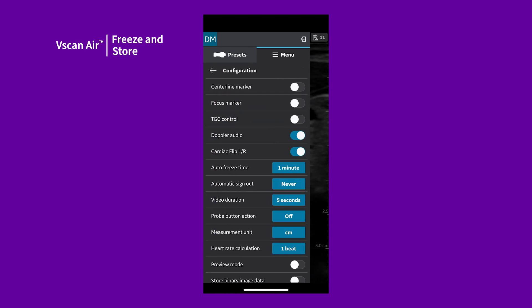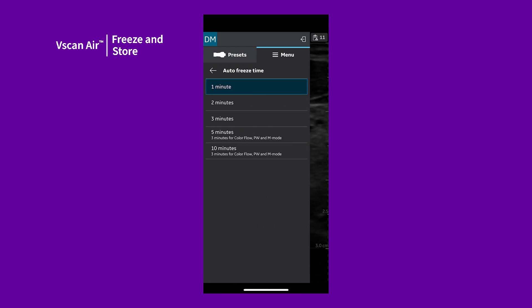Your app can auto-freeze as well. If not already in the Configuration menu, swipe to the right, tap Menu, and tap Configuration. Tap on Auto-Freeze. The auto-freeze time can be adjusted. You can choose between 1, 2, 3, 5, or 10 minutes.